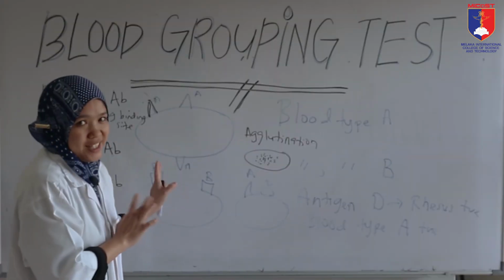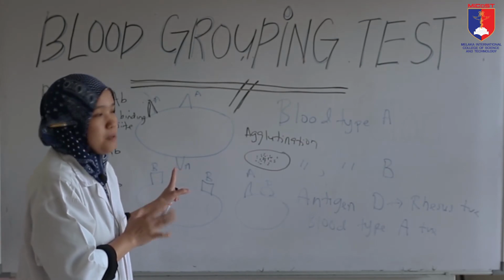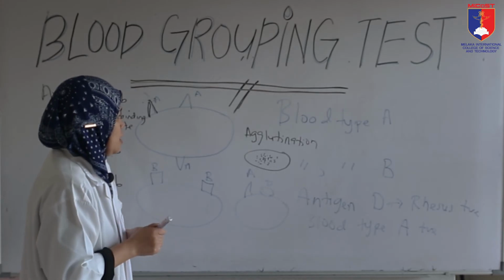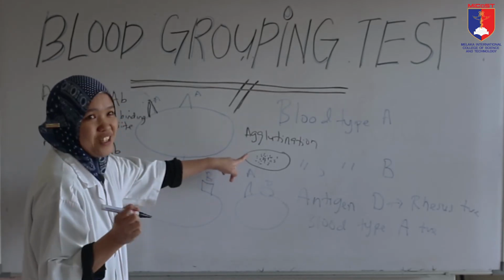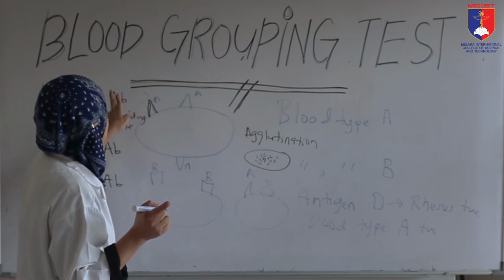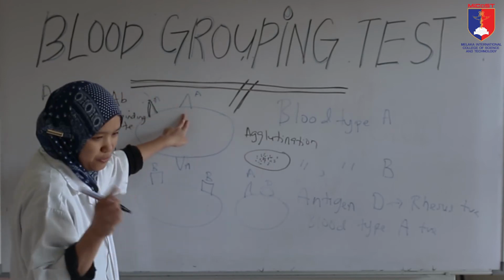Okay, so this is the principle behind this test. If this agglutination occurs, it means that the antibody detected the presence of antigen.